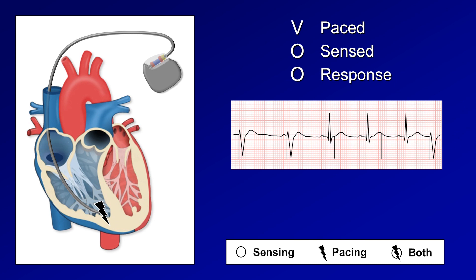There is a mix of different kinds of beats. Here is a ventricular paced beat, identifiable by the vertical pacing spike followed by a wide and unusual QRS complex. Although the pacing spike comes right after a P wave, the pacemaker either has no atrial lead or its sensing function is turned off, so the timing is purely coincidental. The next beat has a QRS complex resulting from normal intrinsic conduction through the AV node and His-Purkinje system.